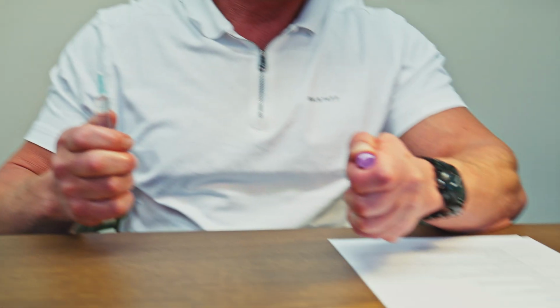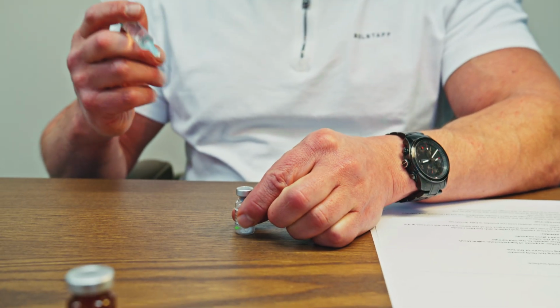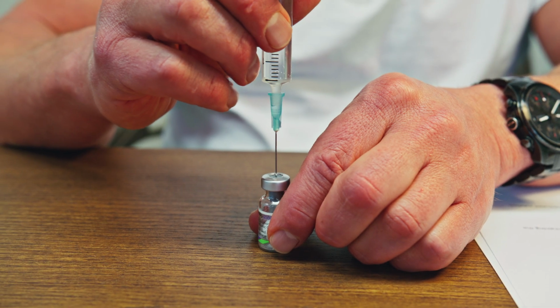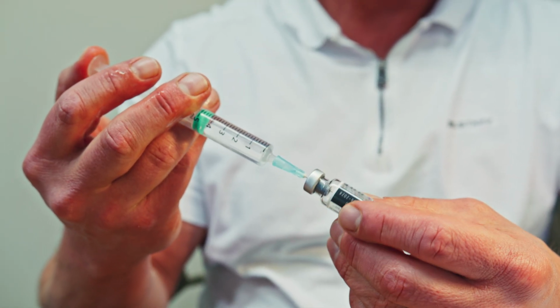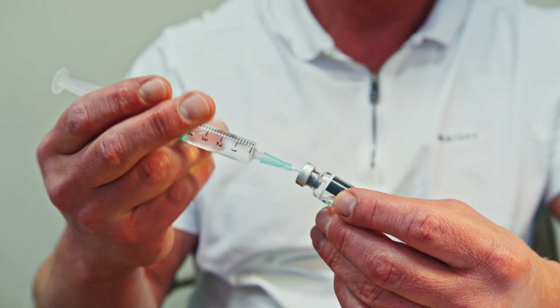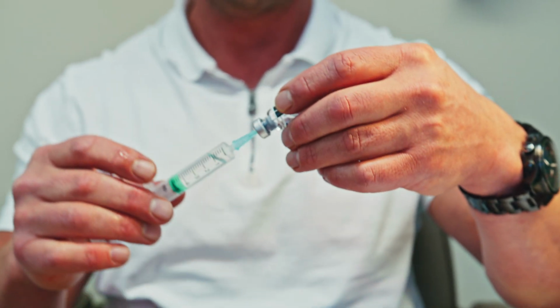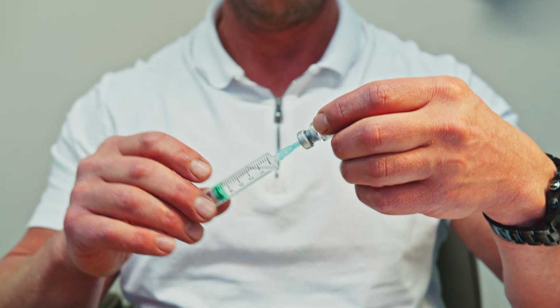Okay, so I'm going to flip the cap off the HCG. And I'm going to insert the needle into the central rubber ring. I'm going to depress the plunger very slowly. Everything is done very slowly and meticulously. There's no need to rush any of this. So put a mil in. HCG is fragile, so you don't shake it, essentially just roll it around, and we're just trying to dissolve the powders.